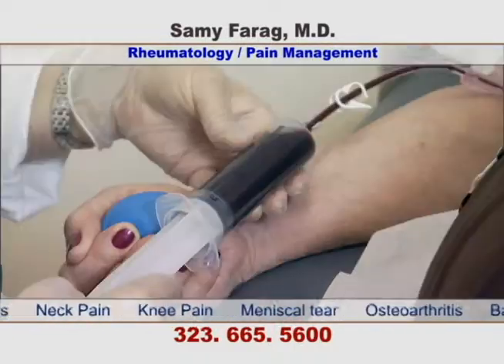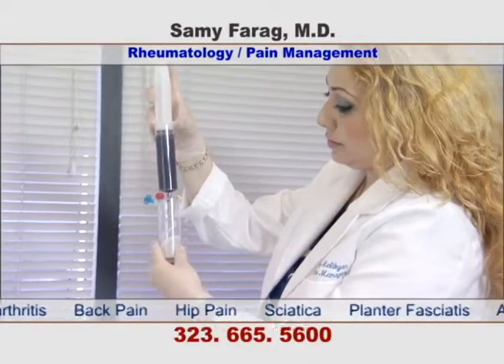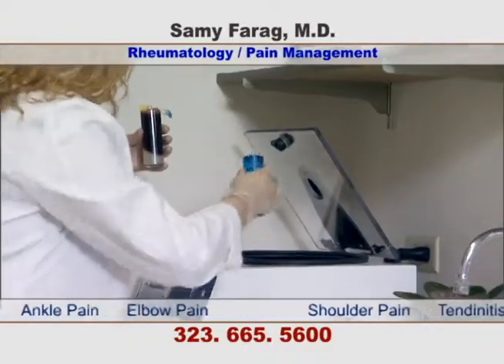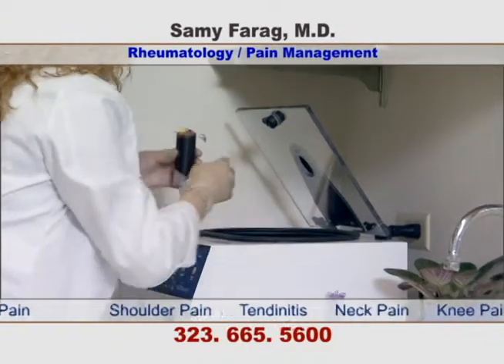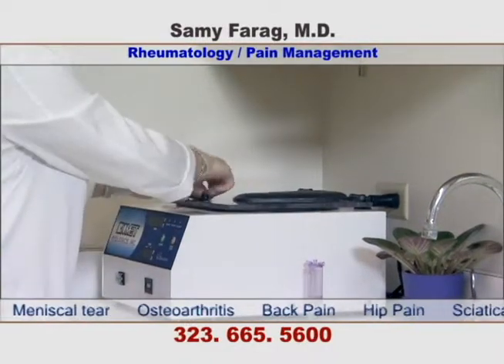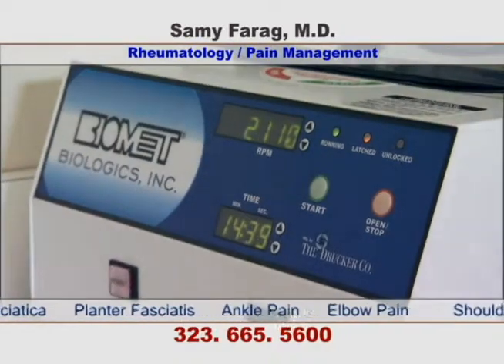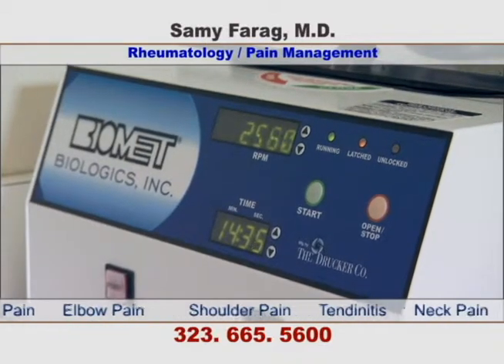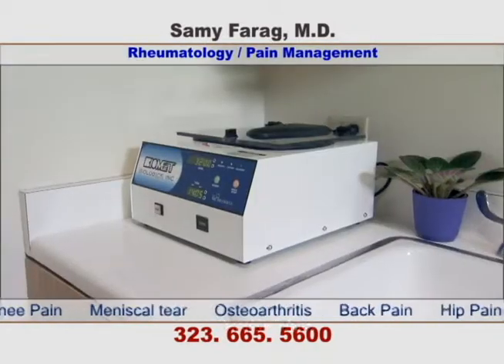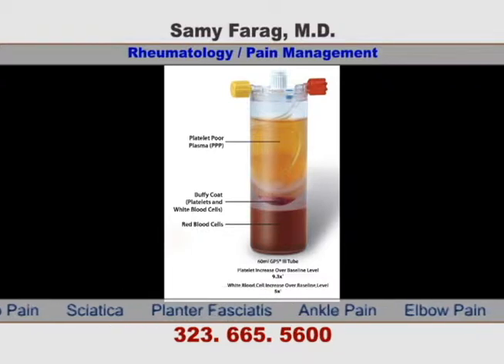First, we draw your own blood and place it in a separating tube. We will place the tube in the centrifuge machine. This process will allow the plasma to be separated and the platelets to be injected. Your blood will be separated into poor plasma, platelets, and red blood cells.